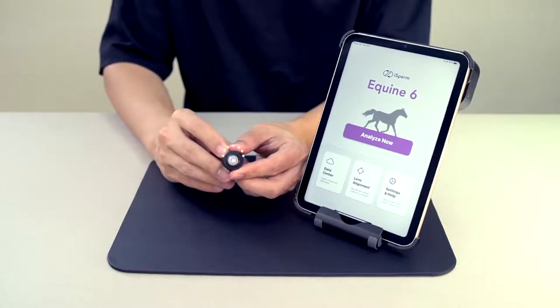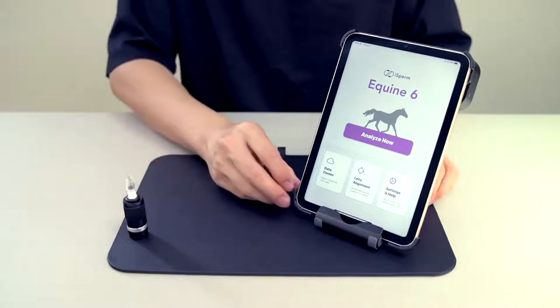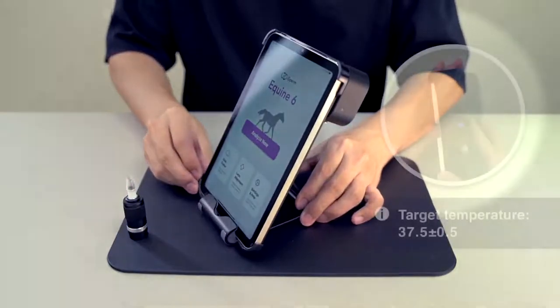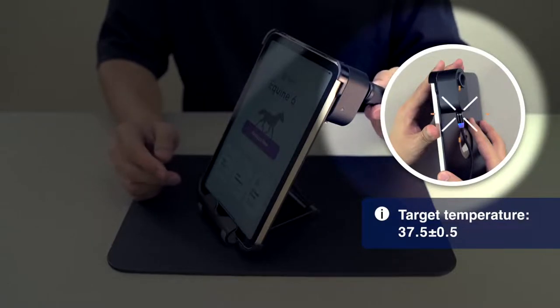Turn the light on and install the sample collector. If you're going to work on chilled or frozen semen, please connect this heating system to a power supply to make sure the sample will be analyzed at body temperature.